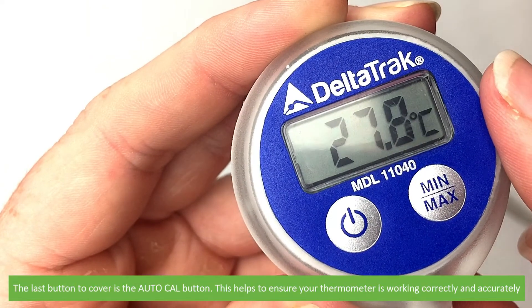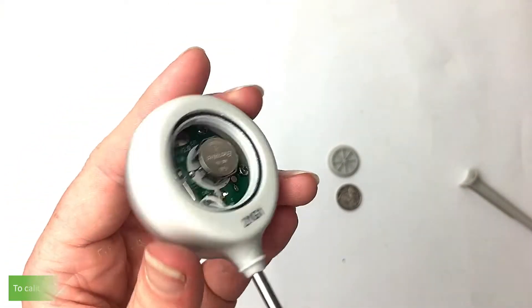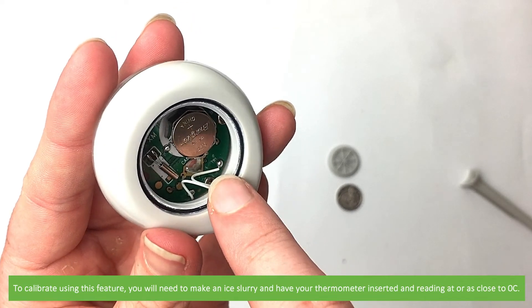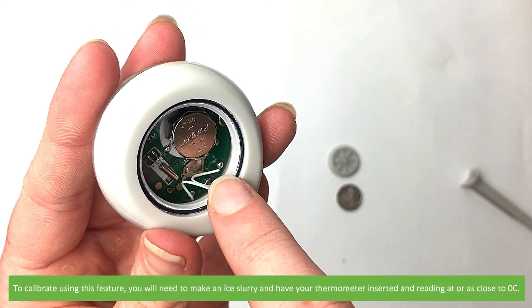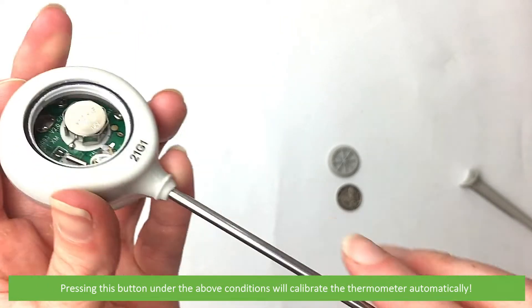The last button to cover is the AutoCal button. This helps to ensure that your thermometer is working correctly and accurately. To calibrate your thermometer using this feature, you will need to make an ice slurry and have your thermometer inserted and reading at or as close to zero as possible. Pressing this button under the above conditions will calibrate the thermometer automatically.